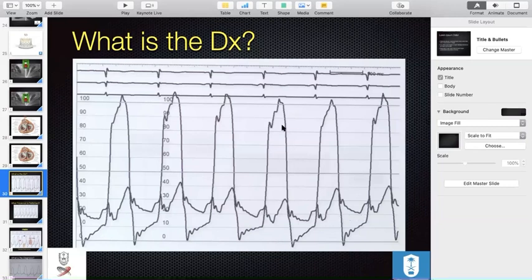Then you say, is the peak within the ST-T segment? It is. So this is a ventricular tracing. So you see the pressure is very high here, 100 it is. So this is assuming a left ventricle, and this is a left atrium. So you identified the chambers.